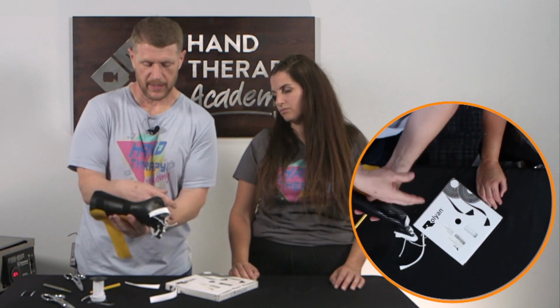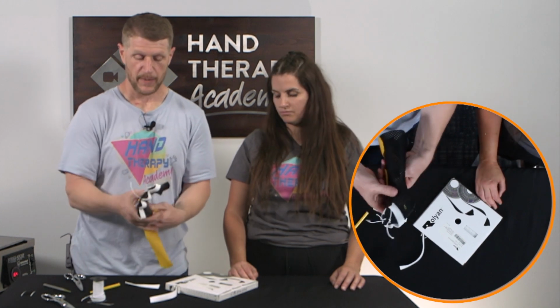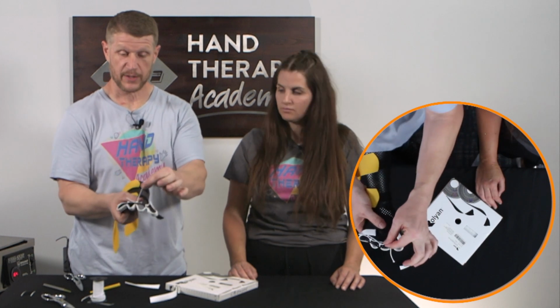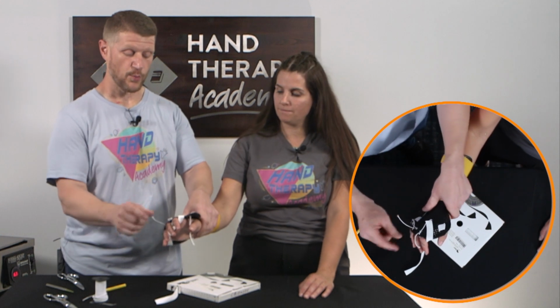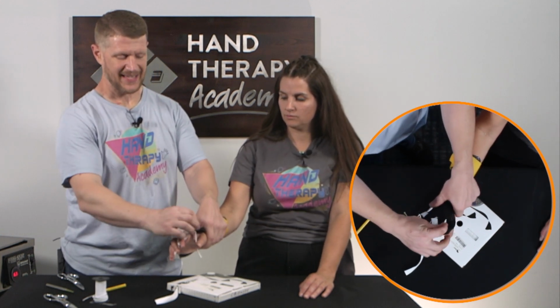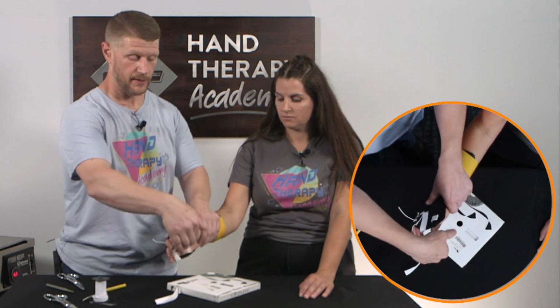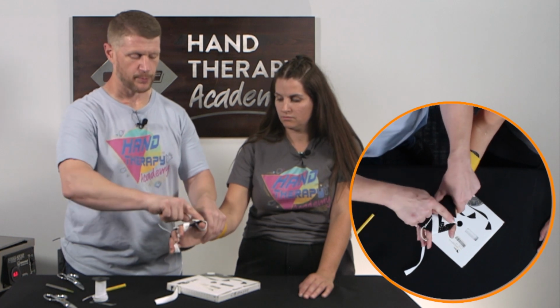Putting it on in that droop position, they feed it into their fingers and then they set it on there. We're going to cut a little slit in here, and I'll show you why in a second. We don't need the string there. We'll show you why that little slit's there in just a sec. Okay, so we made that slit, cut it through here. I lay this over top, and I only want it to cover about half of the sticky back Velcro that I put on there, because now this piece is going to come around and loop around that thumb.